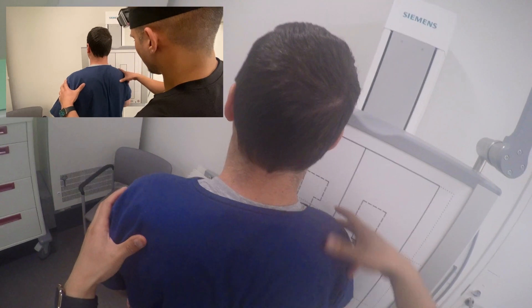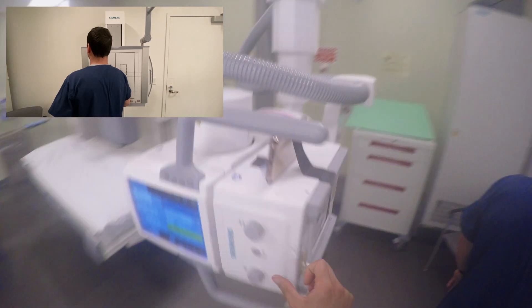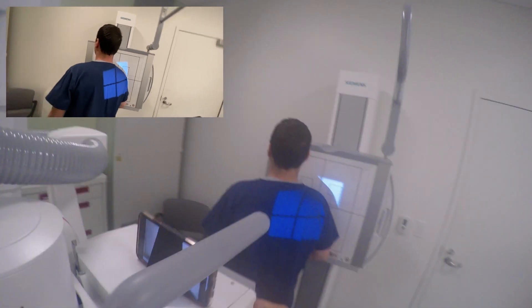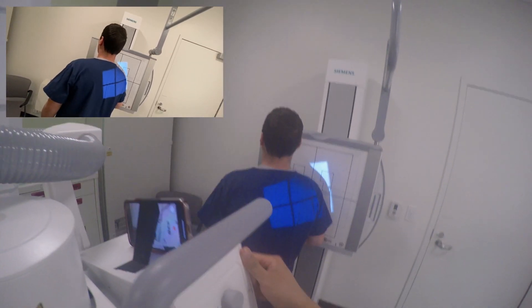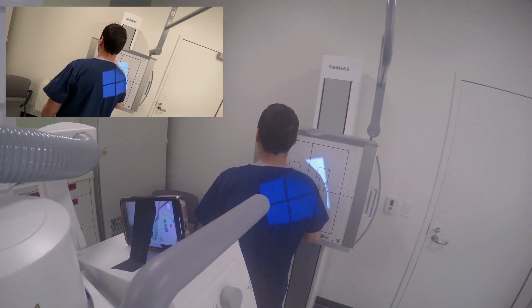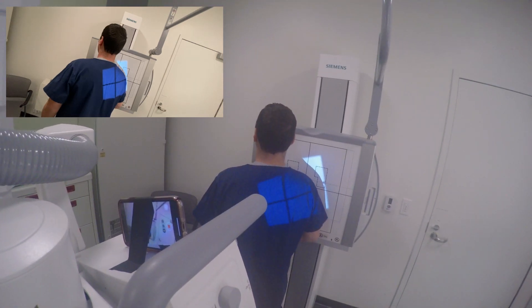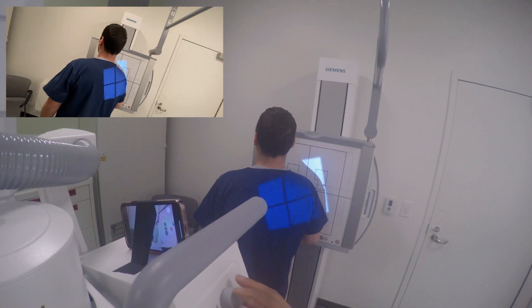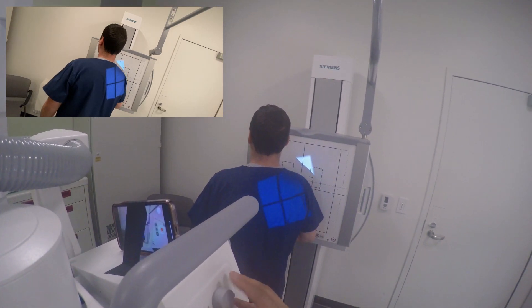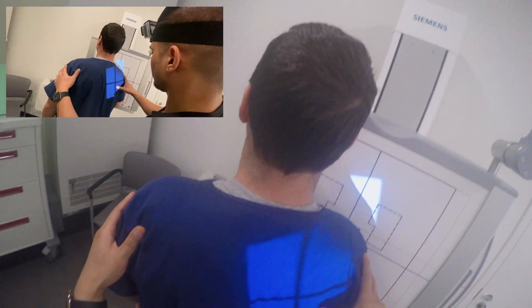I slide him over to where his humeral head intersects the mid-sagittal plane of the wall bucky. This is my pivot point. I then feel for the scapula and pivot the patient so the central ray will intersect the humeral head and scapula. This position is tricky when it comes to collimating — the angle of the patient throws off the light field, but remember it doesn't change. Look back at your collimation box on the tube for reference on the true collimation. Also, with thicker patients, you just need the bone. I caulk the tube so the collimation runs parallel with the Y, eliminating unnecessary scatter and tissue exposure.